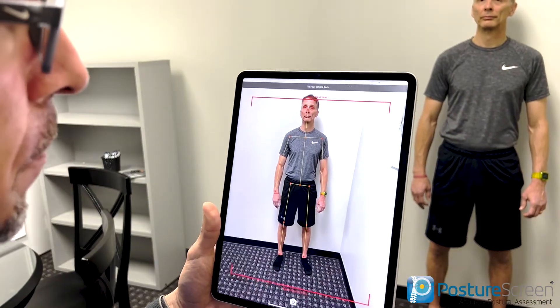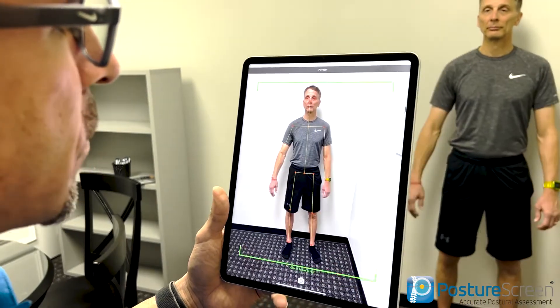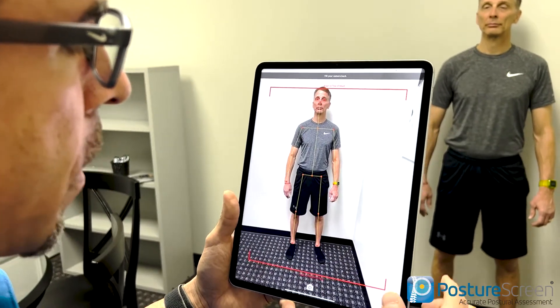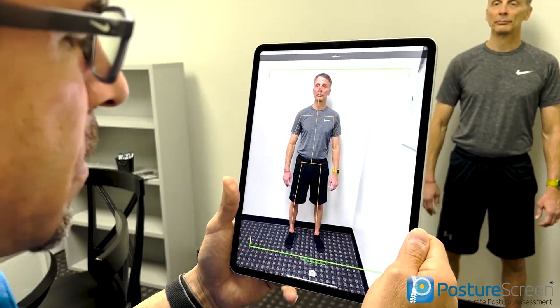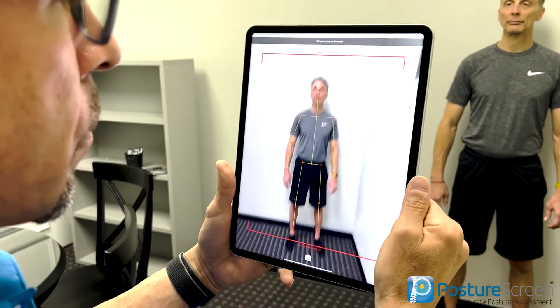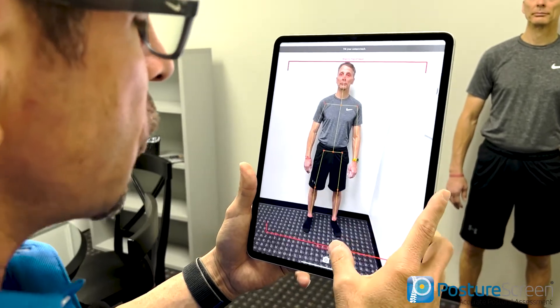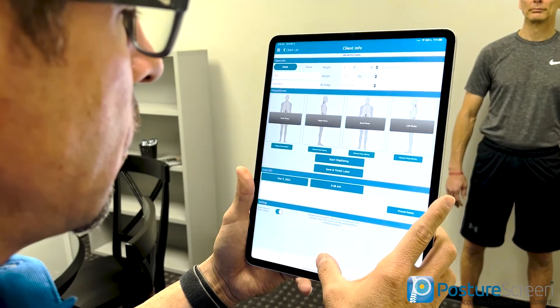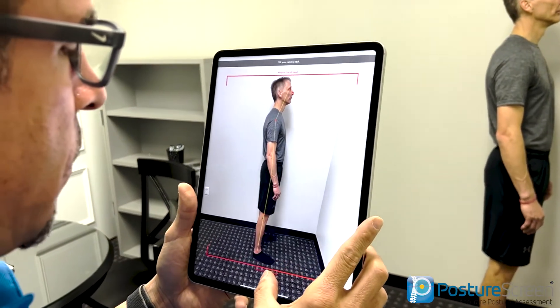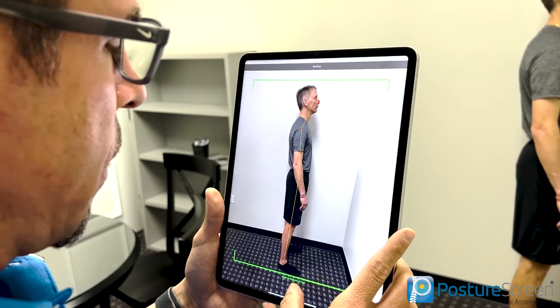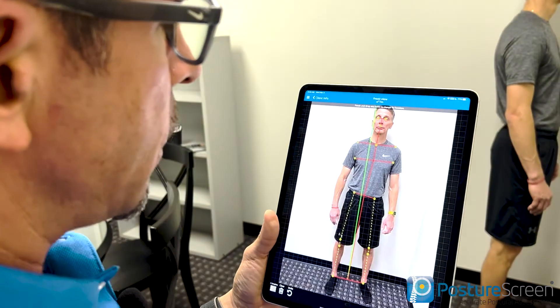At this point you may be prompted to give camera permission — just click OK. Notice how the system tracks the client as they move around, which is why we don't want people walking behind them. Make sure the device is not rotated; you can see indicators turn green when tilted in different directions to help with alignment. Once the assessment is lined up, click the snapshot, then ask the client to turn. You can see it tracks them in real time, then hit 'start digitization.'